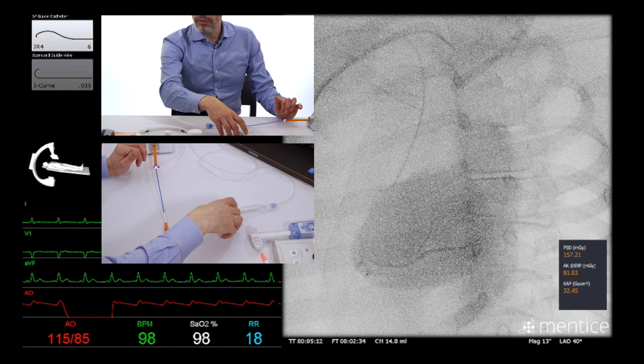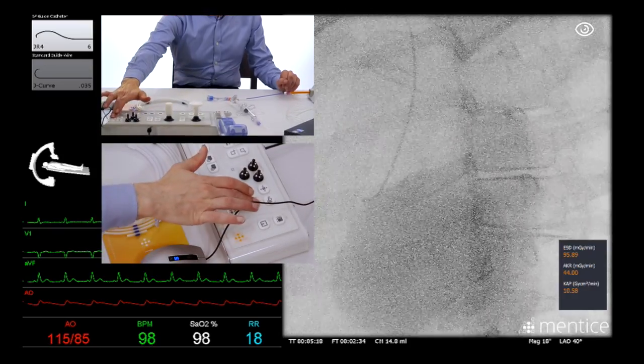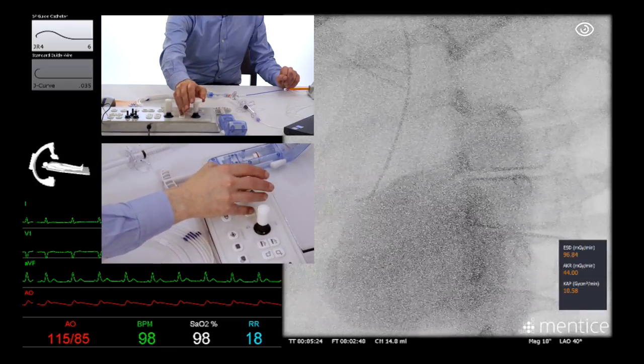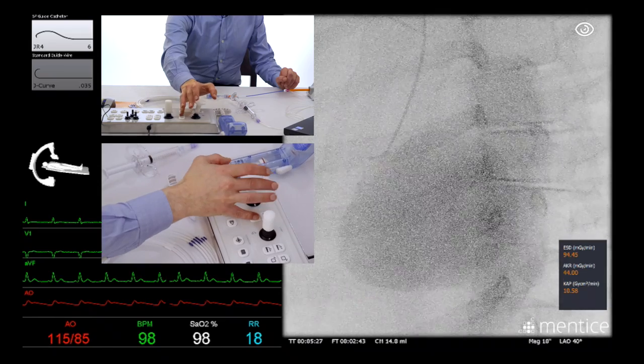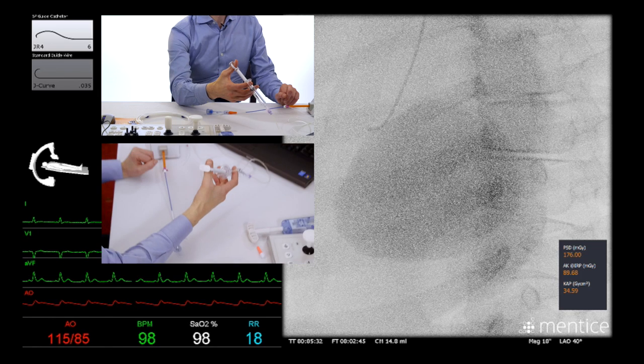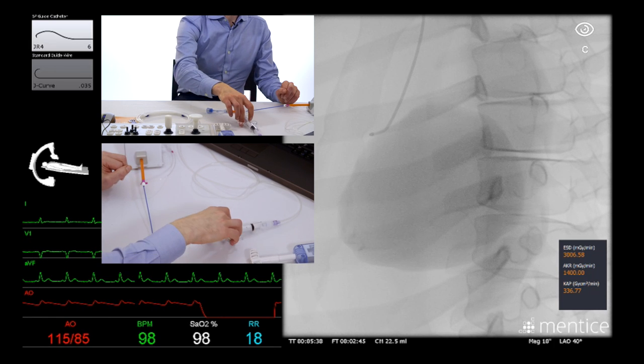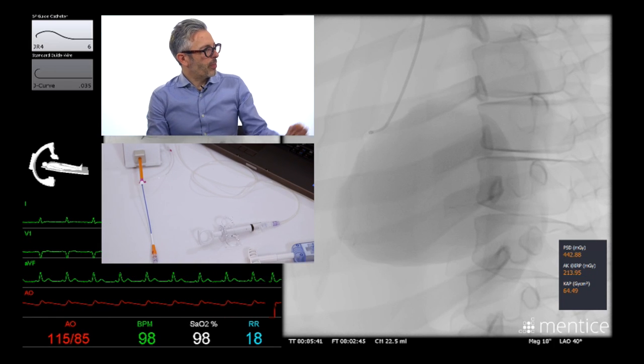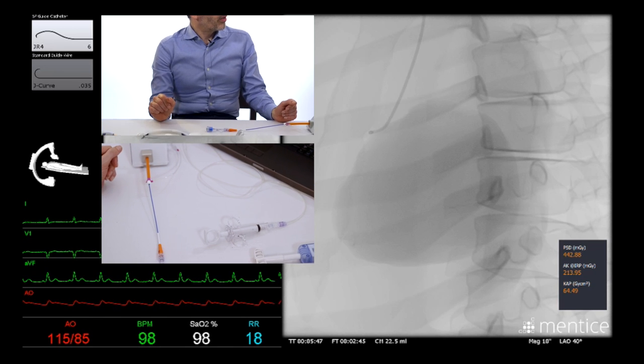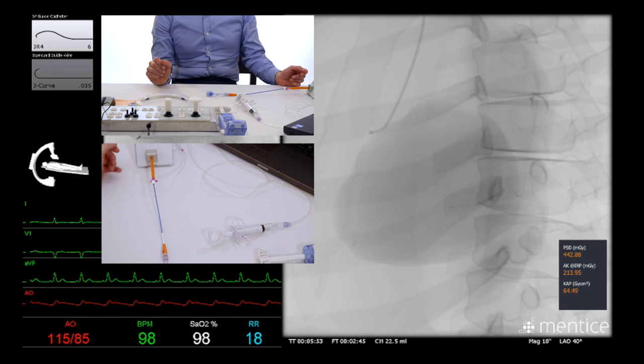Let's take an angiogram in that view. I'm going to mag up one size and change our table position a little bit, just center up on the screen. Now we'll take our cine here and you can see a roadmap appears on the left of the screen. We can see from the picture that in this mid-right coronary artery we have a severe area of stenosis and that's our target for treatment today.